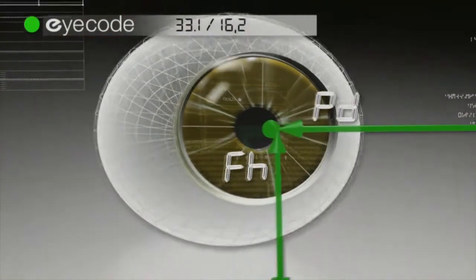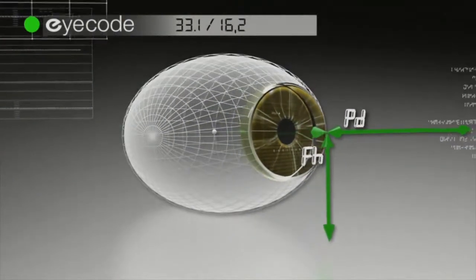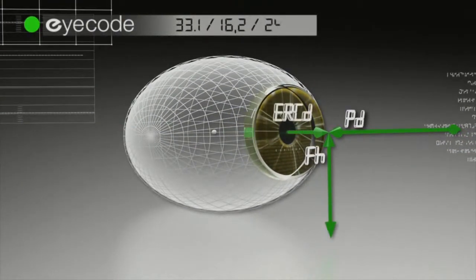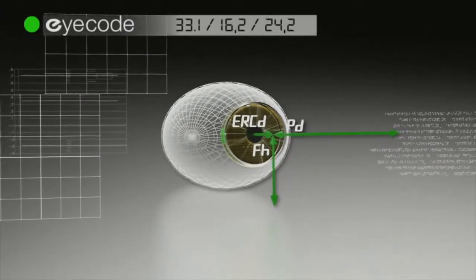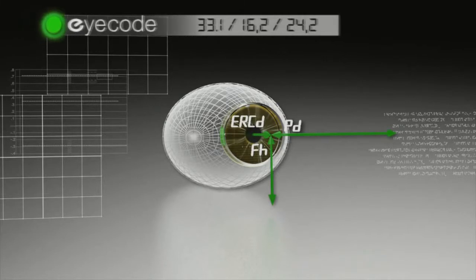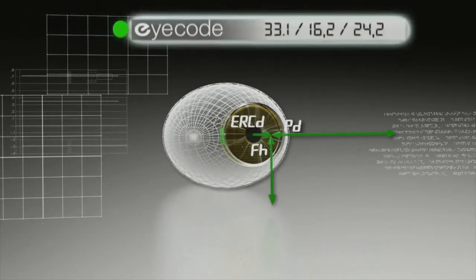The ERC is the new reference for pupillary distance and fitting height measurements. And what was an approximate vertex distance is now replaced by the distance between the eye rotation center and the lens, called the ERC distance, or ERCD.